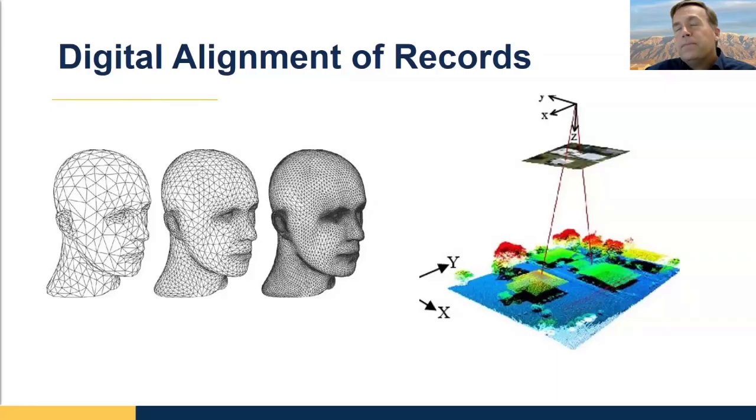Then you scan the lower, and when you scan the lower, you create a file with another origin point. That's why in your software, the two don't seem to be related to each other. Then you go to the bite scan stage, and you start scanning like you're supposed to. And all of a sudden, bam, the two of them snap together. And you're like, what's going on? What's happened is that the software has recalculated both files, so now they have the same origin point. So even though one looks like the upper and one looks like the lower, it's essentially one file from an orientation perspective. So why does that matter?